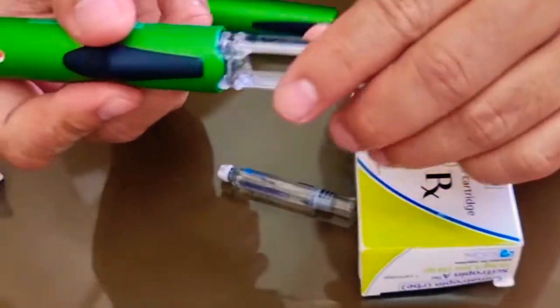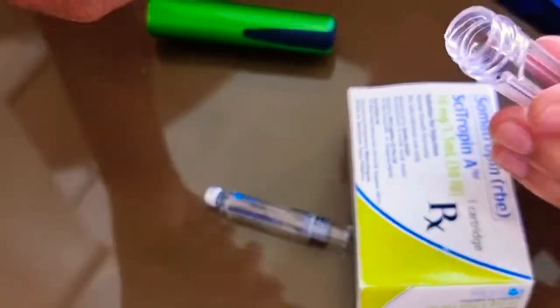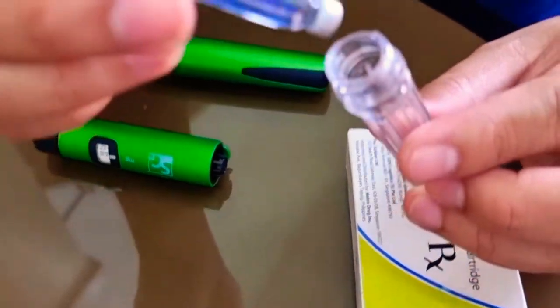So this is how you use the SciTropin autoinjector pen. You open it, and then you remove the cartridge holder, just twist and pull it, and then put the SciTropin vial inside.